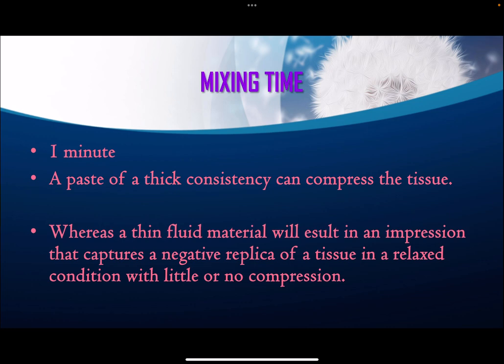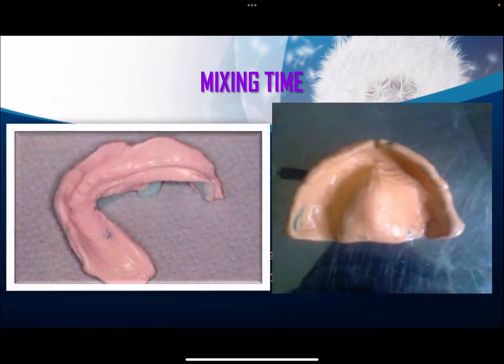Mixing time. A mixing time of 1 minute is recommended. A paste of thick consistency can compress the tissue, whereas a thin fluid material will result in an impression that captures a negative replica of a tissue in a relaxed condition with little or no compression, as you can see in this image.